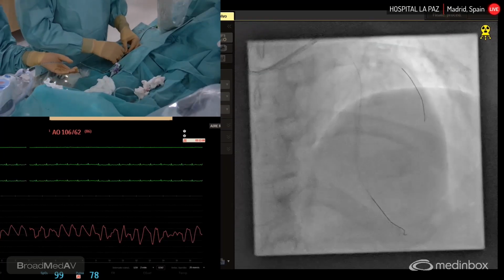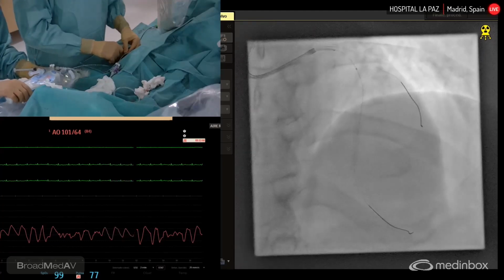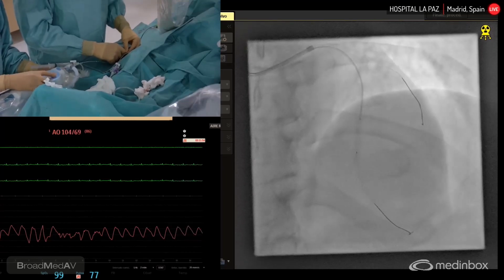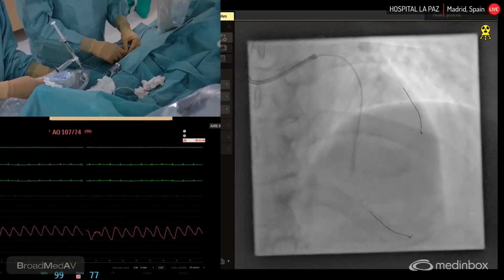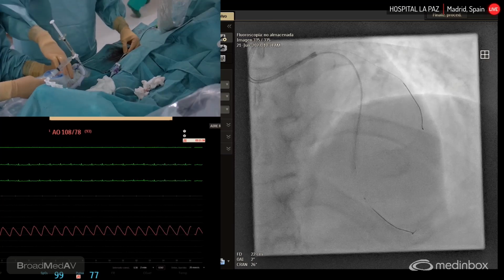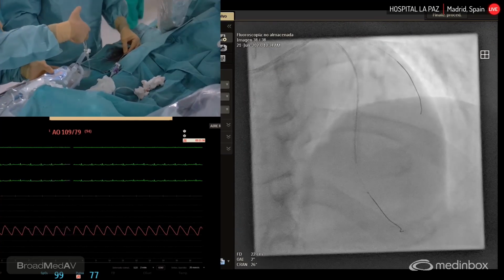And also the synergy stent, that you know they have a lot of data and we use it a lot with very good results. So the interesting point of this trial is that we need to optimize everything with imaging, and it's based on physiology, because we are doing this non-invasive physiology before the procedure. Borja, live, up there. Okay. I'm going to advance a little bit. There, and pull back.